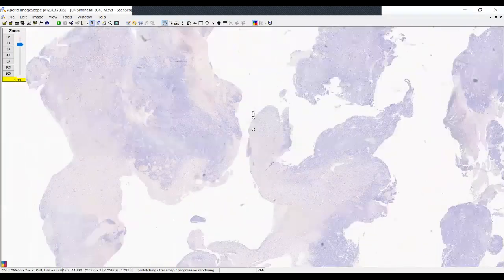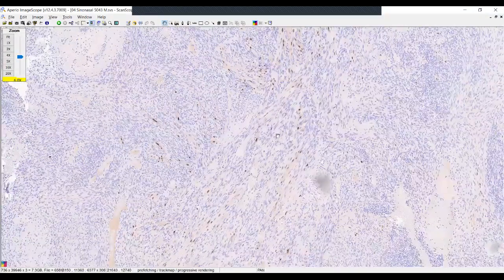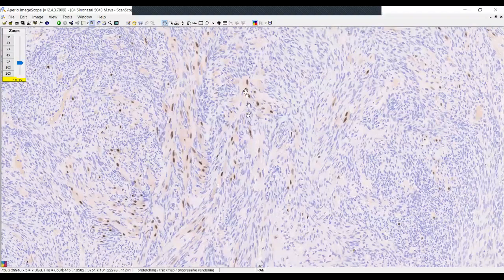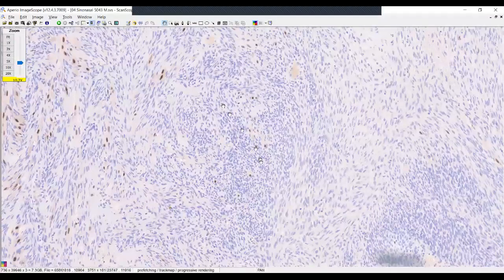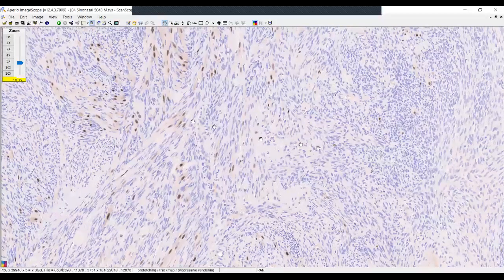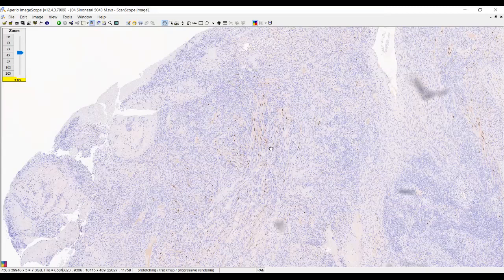So I'm going to show immunohistochemistry here as well. In this example, it happens to be of a myogenin, and I think you can tell that there is a strong nuclear reaction, but only in a subpopulation. So in other words, there are only isolated cells that seem to be reactive, while the rest of the neoplastic proliferation is not. So again, this helps me because if this were a rhabdomyosarcoma, then everything should be positive, not just the isolated areas showing rhabdomyoblastic differentiation. Of course, since we're in the sinonasal tract, you always have to think about a spindle squamous cell carcinoma, and it is well known that spindle squamous cell carcinomas also can have areas of rhabdomyoblastic differentiation.